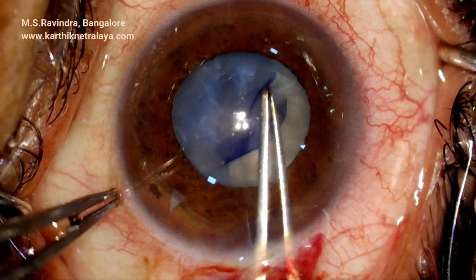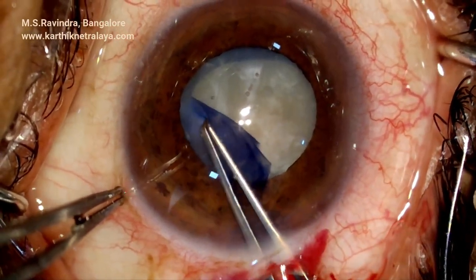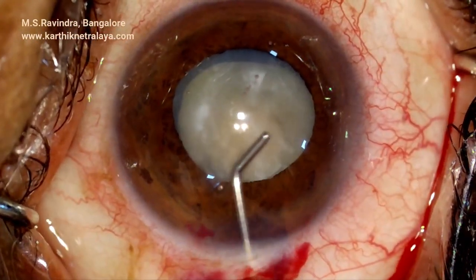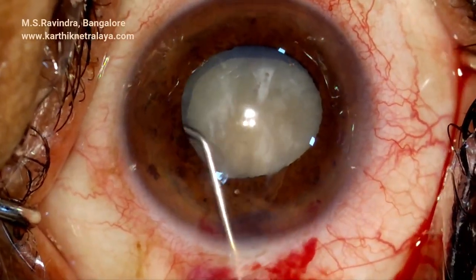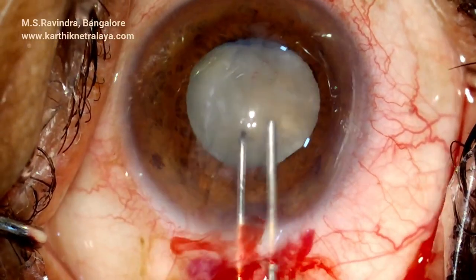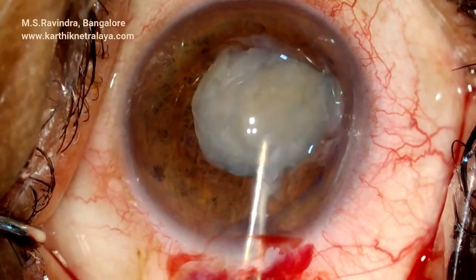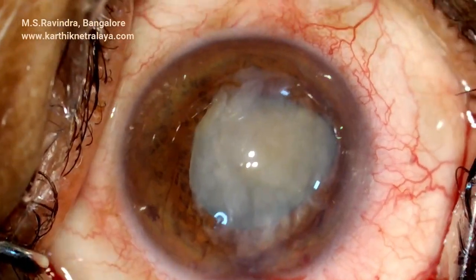The viscoelastic is infused into the eye repeatedly. This is 1% lignocaine. The nucleus is rotated in the capsular bag and prolapsed into the anterior chamber manually using a 25 gauge cannula and a Sinski hook — one pole is lifted up and using it as a lever, the entire nucleus comes out.